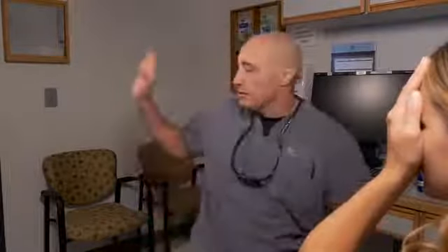Cover your left eye with your left hand — I'm just making sure her hand is totally covering her eye. If you have an occluder available, that's also an easy way to do it. With your right eye, tell me what the smallest line is that you can see on the chart. If a patient is able to see 20/40 or better, we let it go at that. If they're seeing less than 20/40, I'll use the pinhole occluder to see if there's a refractive error involved.